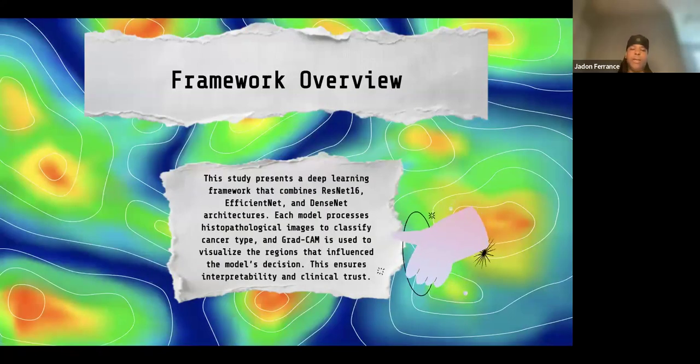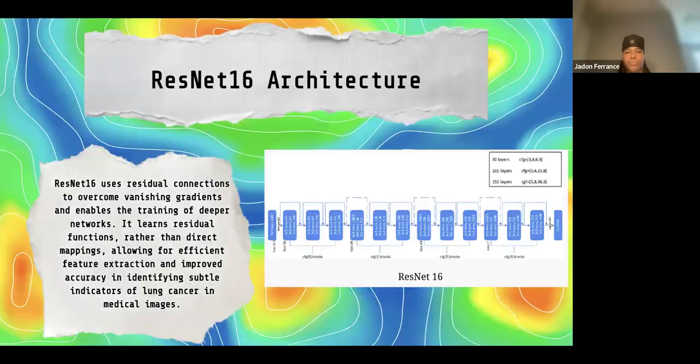This is where deep learning, especially convolutional neural networks, also known as CNNs, plays a transformative role. CNNs can learn complex visual patterns, automatically detect cancerous nodules, assess tissue texture and shape, and even estimate cancer stages with minimal human oversight.